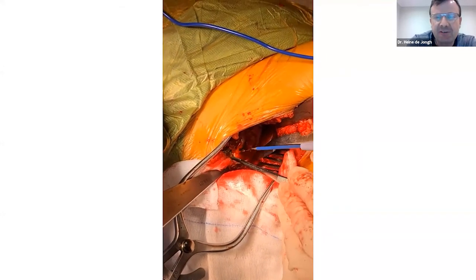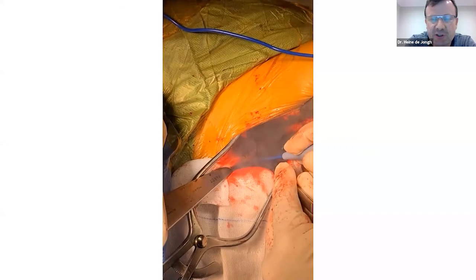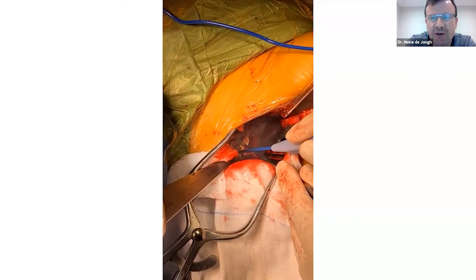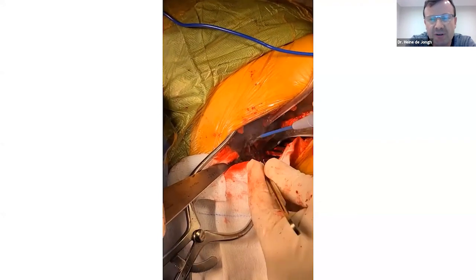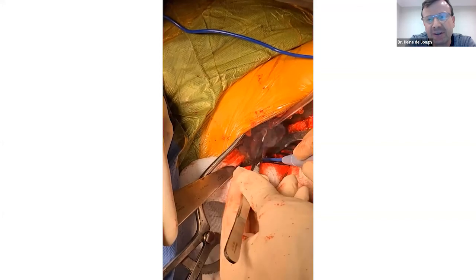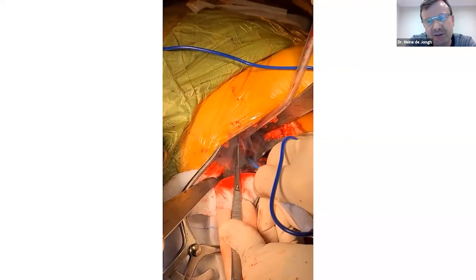Another safety tip that I can add to your list, Jack, is stick to the basics. Just because it's a different approach, especially when you do your acetabular preparation, just continue with the normal things that you do. Remove all the soft tissue, removing the labrum, so that you can identify the anterior and posterior rims very properly. Here you can see my retractors on the medial side, just over the edge of the transverse ligament, and I use my Norfolk retractor here.